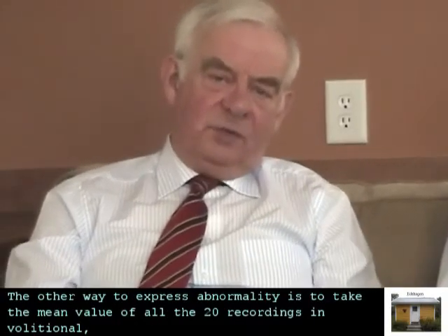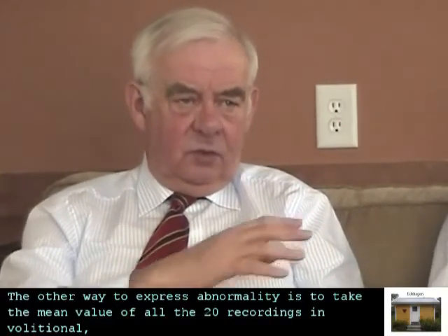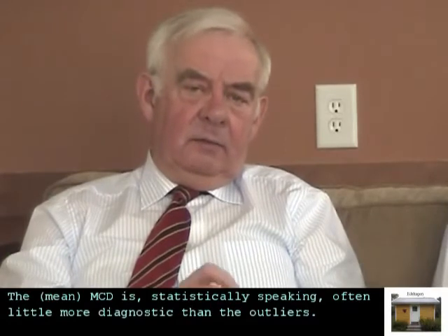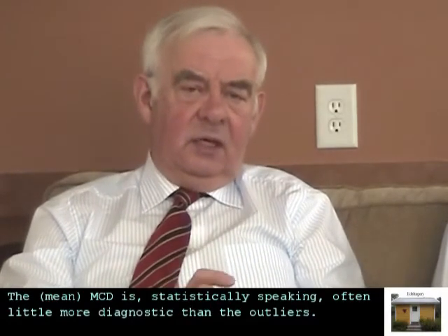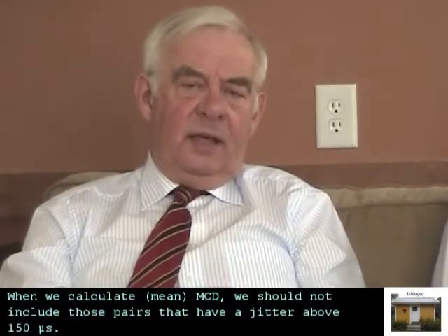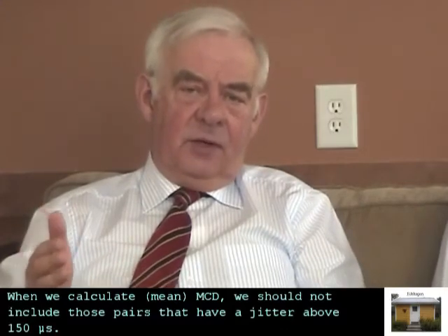The other way to express abnormality is to take the mean value of all the 20 recordings in volitional or all the 30 or 40 in stimulation SFEMG. The MCD is, statistically speaking, often a little more diagnostic than the outliers. And when we calculate the MCD, we should not include those pairs that have a jitter above 150 microseconds.